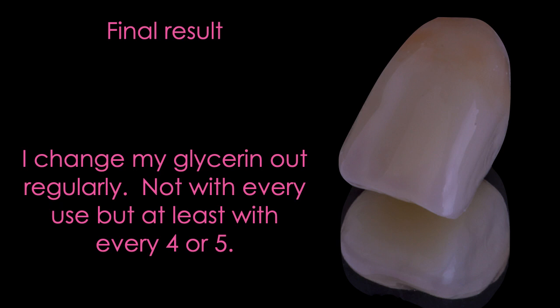I'll make any occlusal adjustments chairside and then do this quickly to make sure I get a nice smooth finish on that restoration. I do change my glycerin out regularly — I think it does go bad from dipping fingers or restorations into it. I use regular vegetable glycerin, which is about ten dollars on Amazon. After every four or five cure cycles, just change it out and get some fresh glycerin in there.